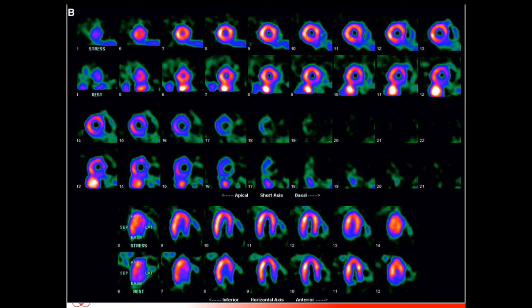And if you don't realise that to be the case when you set up the patient inside the scanner, the orientation of the heart will be the wrong way around, easily fixed. You simply turn the patient around. If they were going in head first, you put them in feet first, and obviously you have to remember to switch around the ECG leads to get the ECG gating correct.